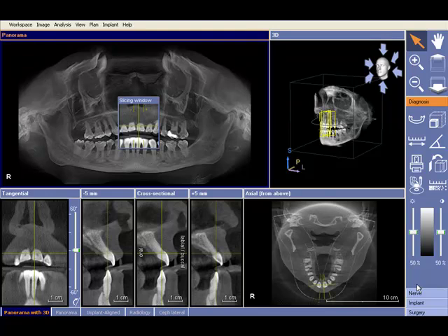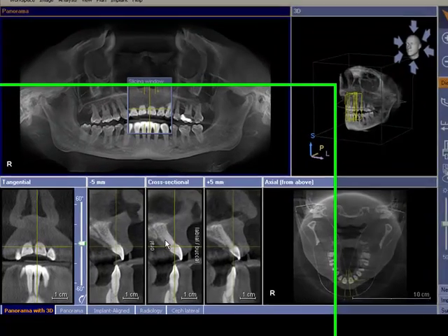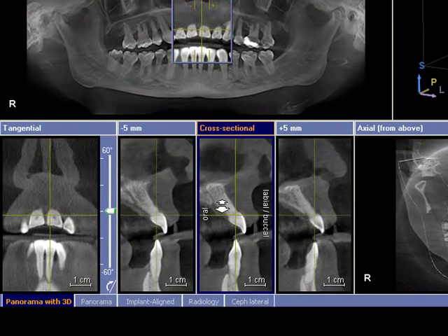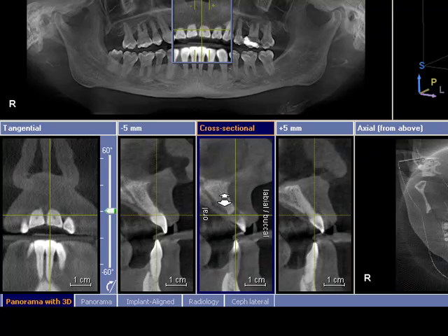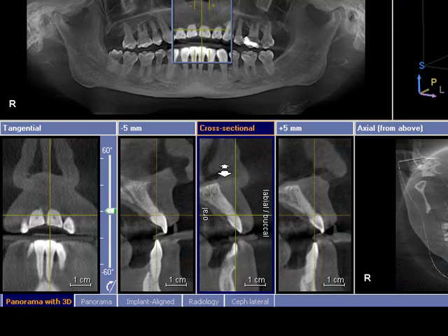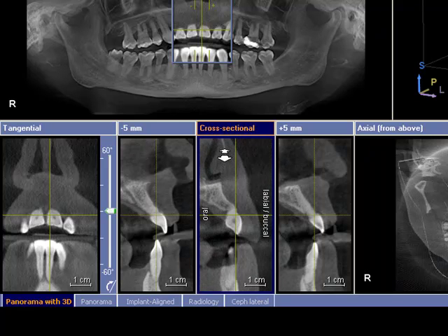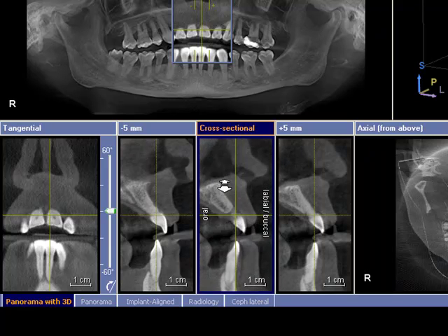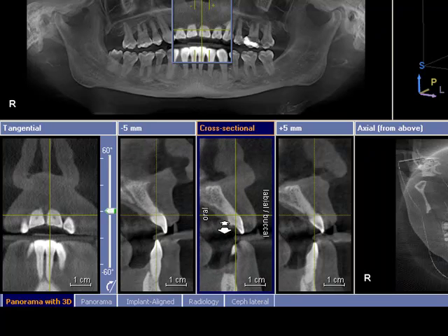In this example I'll be showing you how to scroll through your Wrap and Go volume. What we'll need to do is have our left mouse key held down — left mouse click once and hold — and you can see the arrows that point up and down, meaning that you can scroll through and scroll back to any area of interest.